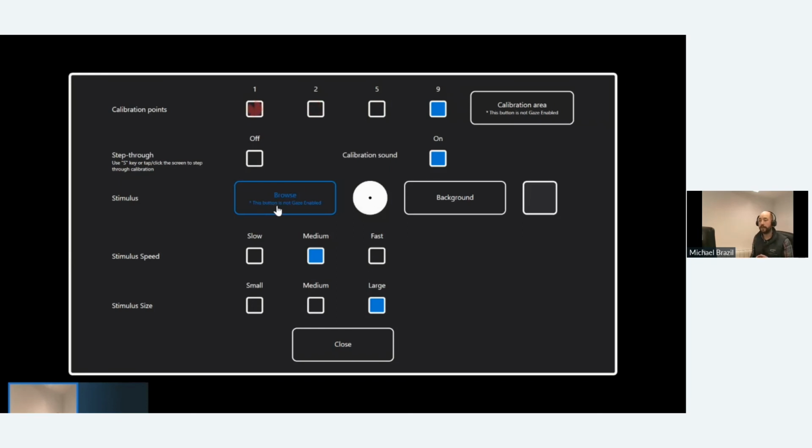Basically that requires less accuracy. As we look around the screen, it's going to pull our eye gaze towards whatever it is anyway at a lower accuracy itself. Okay, so again, I'm just going to do a calibration on a lower calibration point setting. So on 2, we look at close.